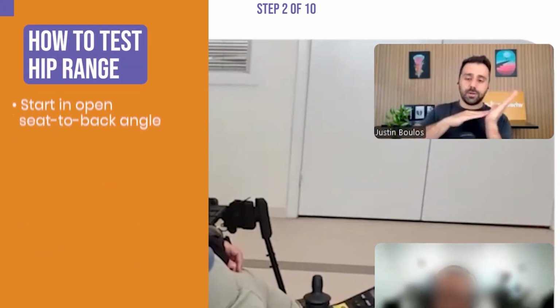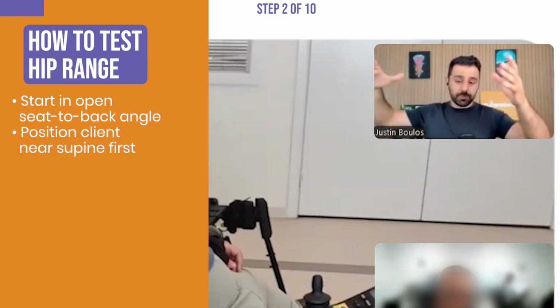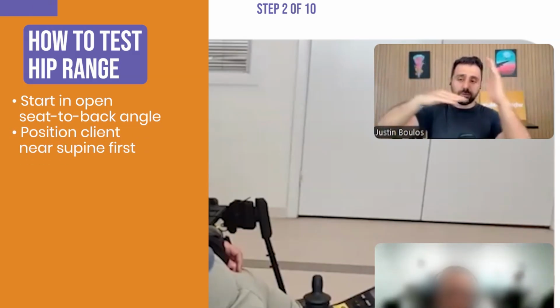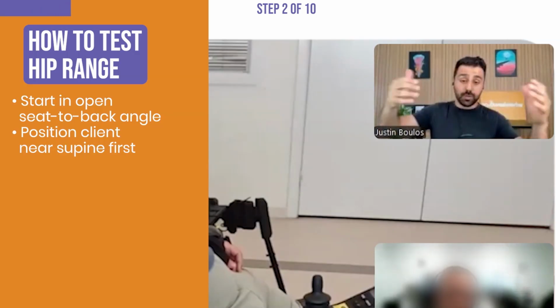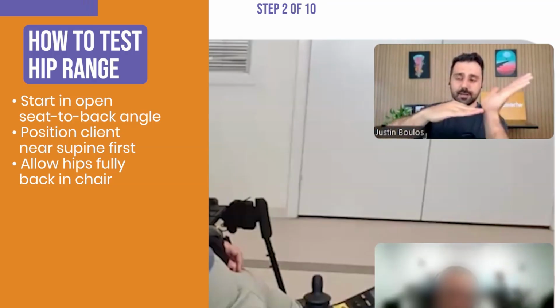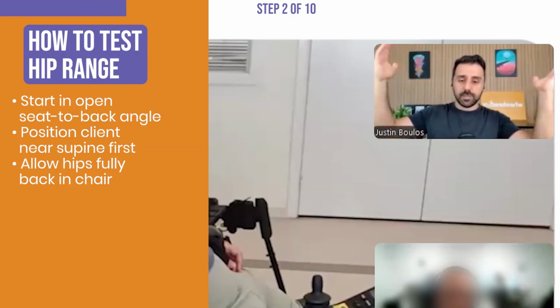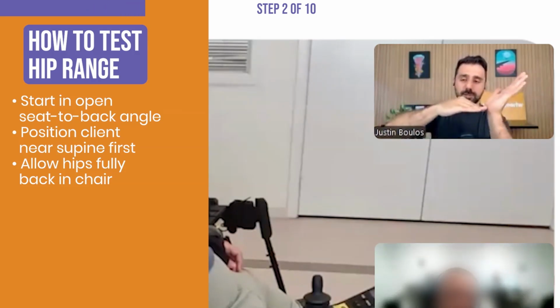I would lay her out quite flat, like I was saying earlier, like a supine position, and then we pop her into the chair like that. So you imagine this chair that had recline and it was like this, and it was shorter. It would allow us to get her hips all the way back. And regardless of a hip limitation, doesn't matter because she's well opened up at this point. So it's almost like a supine position. Like if she can lie down, sweet, let's open up the chair.